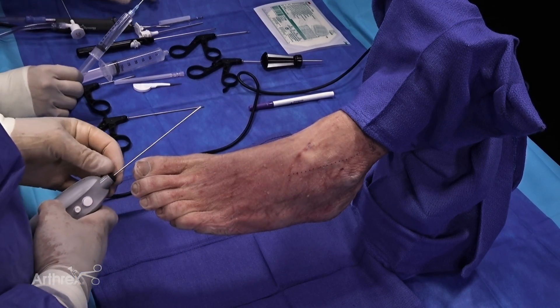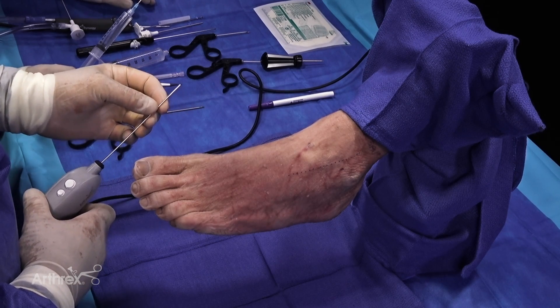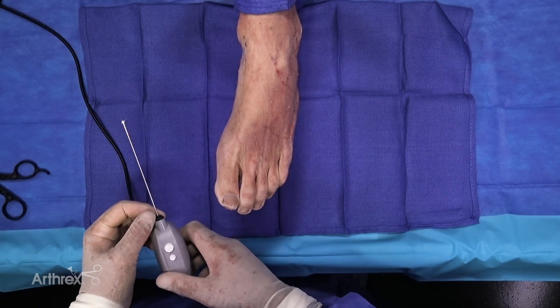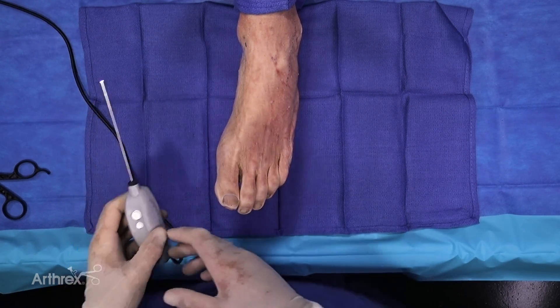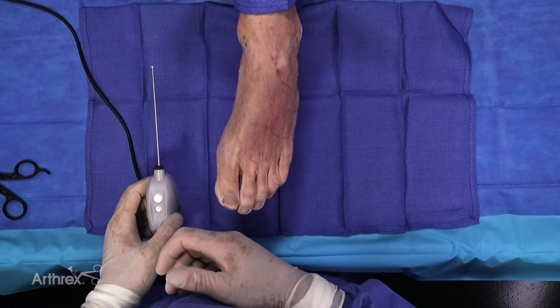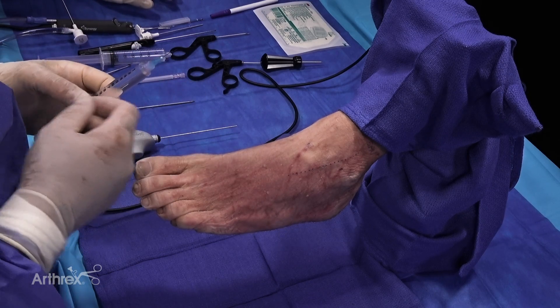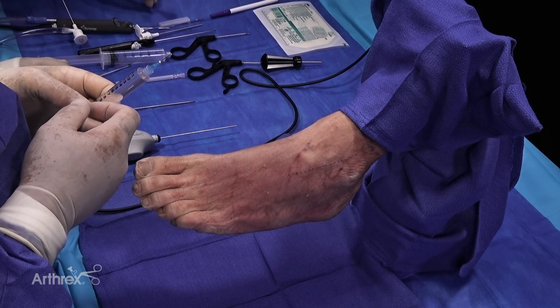We're here with this new technology, this nanoscope or needle technology. You can see this is a very tiny needle-sized scope, 1.9 millimeters in diameter, and we're going to be using this today on the ankle. It can be used all around the ankle for various pathologies. We're going to be looking at the front of the ankle to see if there's any anteromedial impingement and resect that if necessary. We can do this in a normal operating room, but we can do it in a treatment room, and in fact I have been doing this in the office setting where the patient is just given a small amount of local.